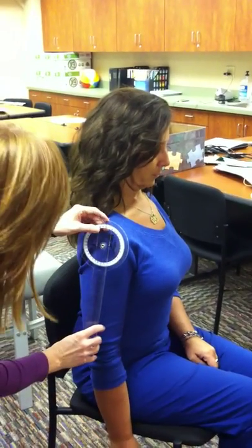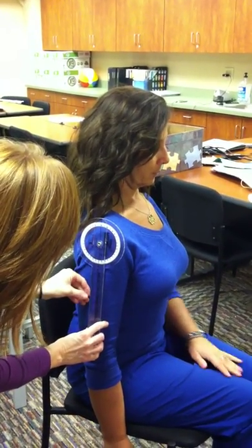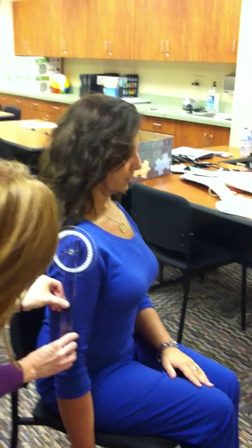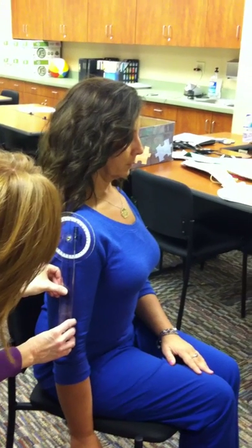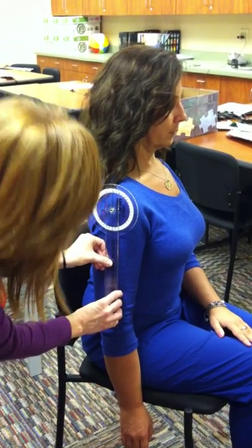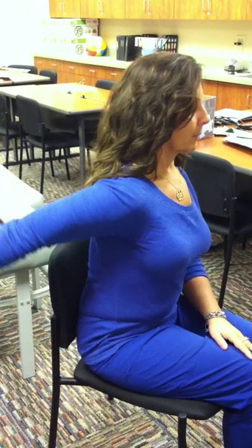You want to take and put the axis on the head of the humerus, and you want the stationary arm to be parallel to the body, and the movable arm to be midline of the humerus. Then you ask your client to move your arm back as far as you can.